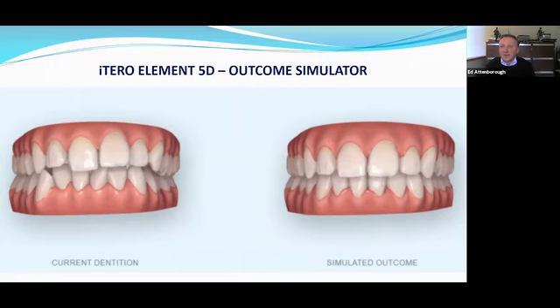So a couple of other things that we've kind of touched on, and this is where not only is the software great for helping you show that your prep is appropriate and giving you that real-time feedback, but also in predicting outcomes. So iTero have an outcome simulator so that they can actually simulate what the patient will look like if they have the treatment done. And that is a great planning and communication tool for the patient, and very, very useful.